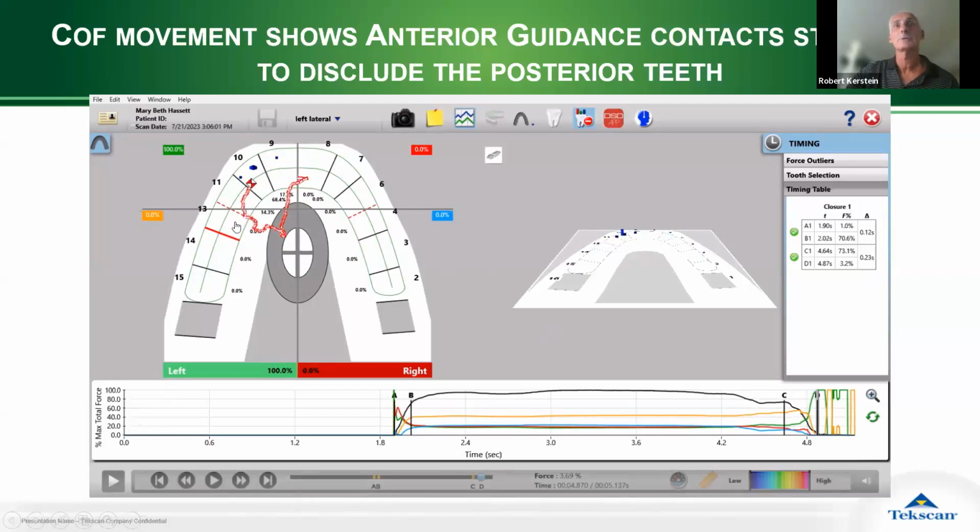So lots of little jogging around means the guidance isn't that good either. So even with a short time frame, right? The time frame is a guideline, but these are also reflections of the quality of the result. The time frame may be great, but the pathway may not be. So you might have to do a little more work there.